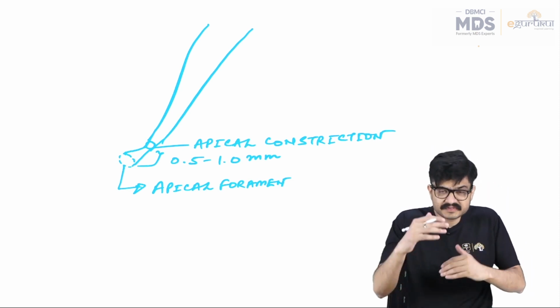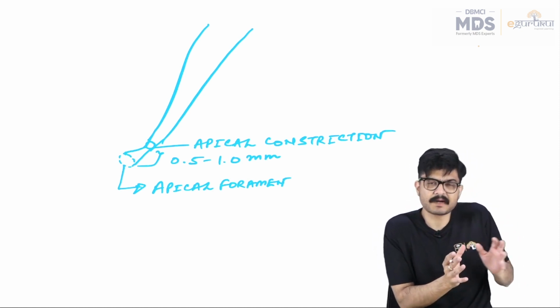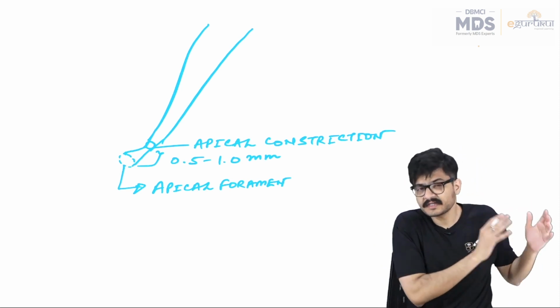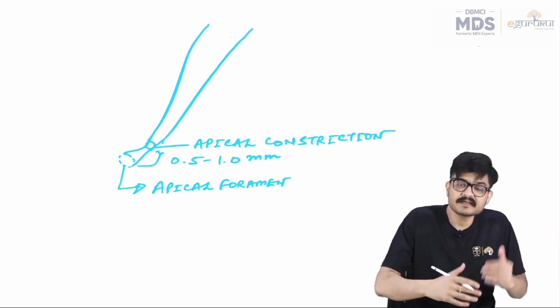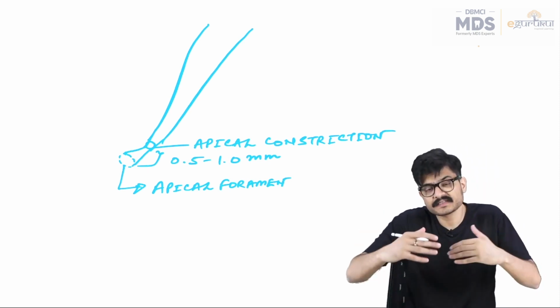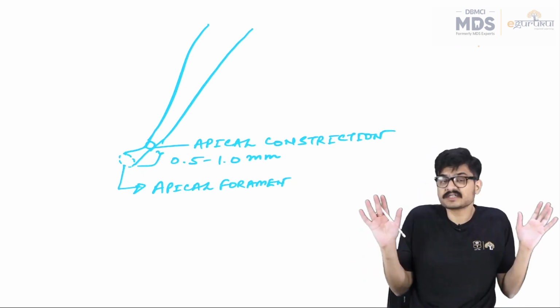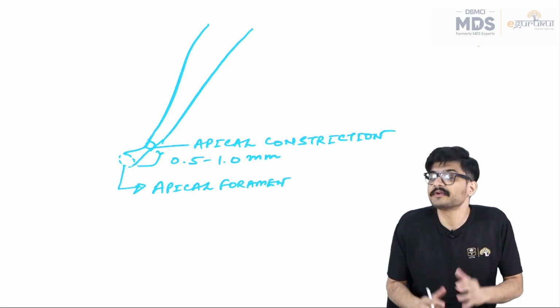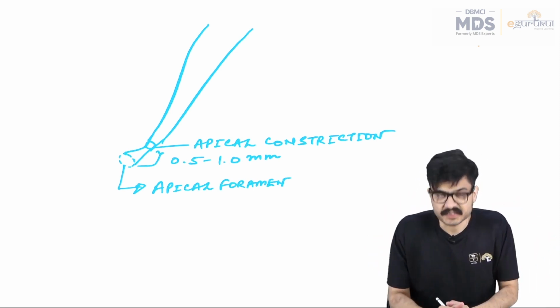You can interpret that as 0.5 mm for the eccentricity of your apical foramen, which may not coincide with the radiographic apex, and a further 0.5 mm for the apical constriction being short of the apical foramen. This also does not necessarily ensure that you have restricted yourself to the apical constriction, but yes, you have to take that chance.